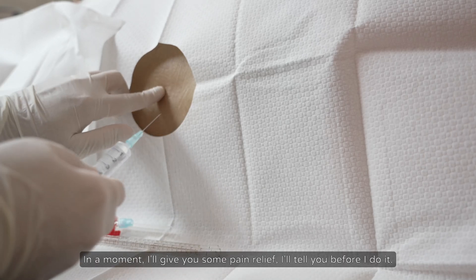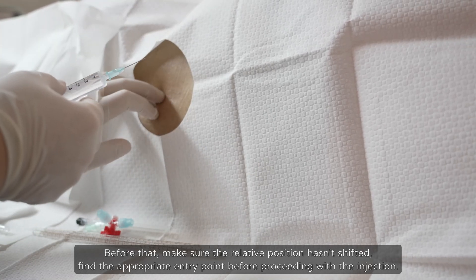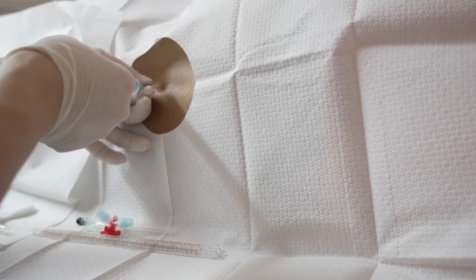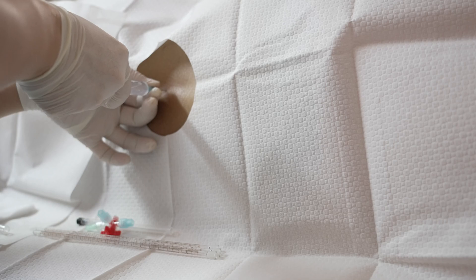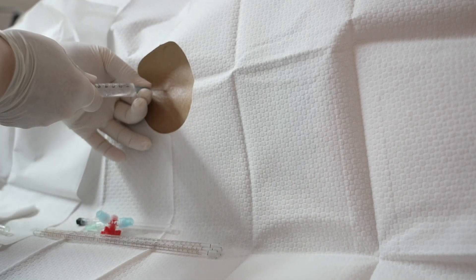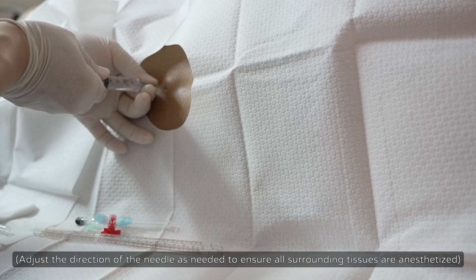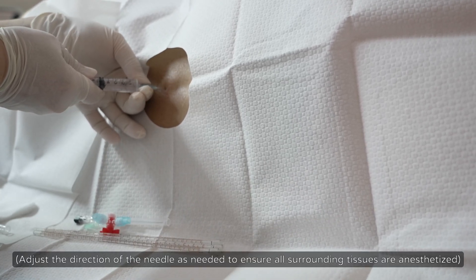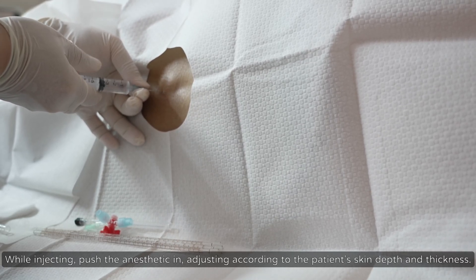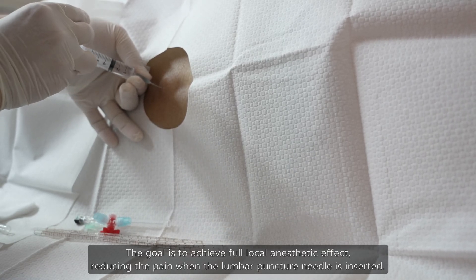In a moment, I'll give you some pain relief — I'll tell you before I do it. Before that, make sure the relative position hasn't shifted; find the appropriate entry point before proceeding with the injection. First, pull back a little bit to make sure there is no blood return, then the needle can go deeper. We will slightly swell the skin here — it will hurt a bit, please bear with it. Adjust the direction of the needle as needed to ensure all surrounding tissues are anesthetized. While injecting, push the anesthetic in, adjusting according to the patient's skin depth and thickness. The goal is to achieve full local anesthetic effect, reducing the pain when the lumbar puncture needle is inserted.